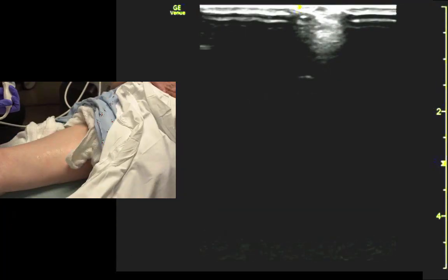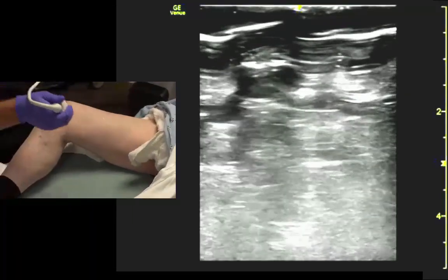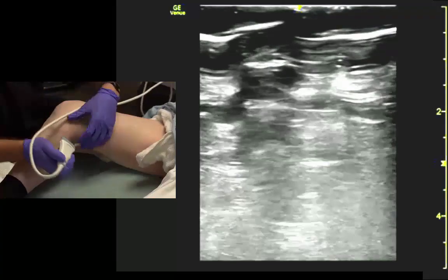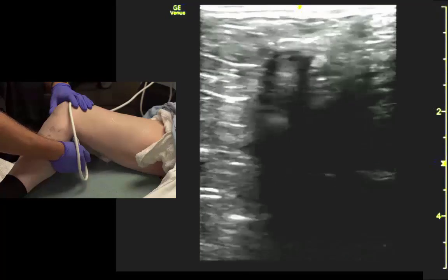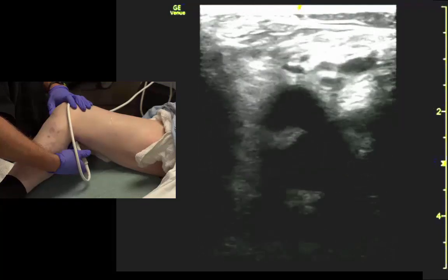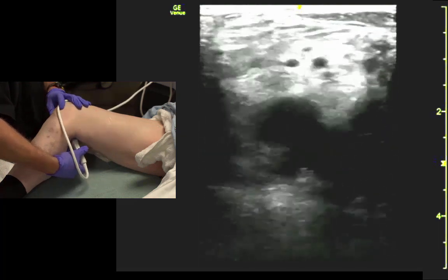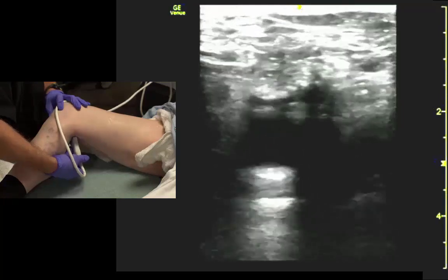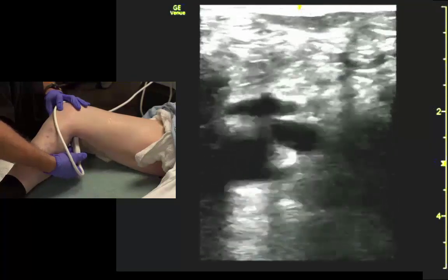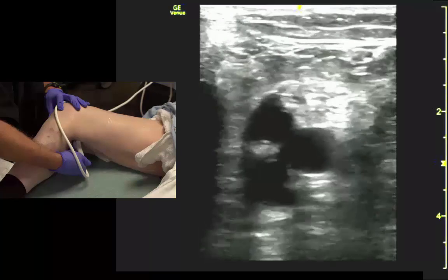We get into the popliteal fossa. Grab the transducer and get right in the crease. Identify the vessels, make sure the vein collapses, and track it proximally until you see all the branch points — the popliteal trifurcation. Make sure all the branch points compress. You can see it branching there — all those venous structures should collapse.